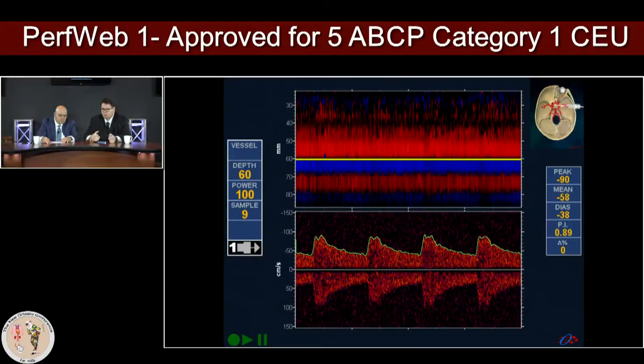So this is just one more example of how a TCD screen looks like. And what you see here on the right-hand side is the speed information. On the left-hand side, it shows you the depth of the signal was calculated, and the signal is represented by this yellow line. So that's the depth of the yellow line where the speed curves are received and calculated.